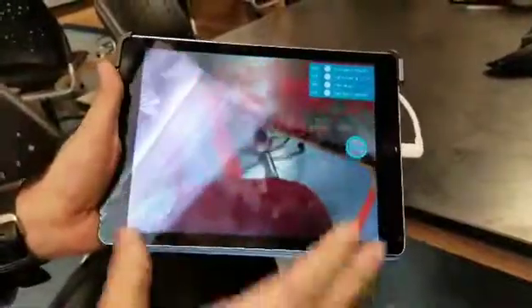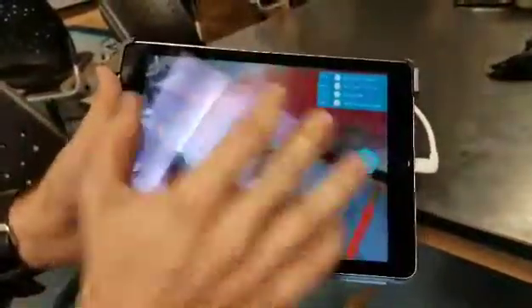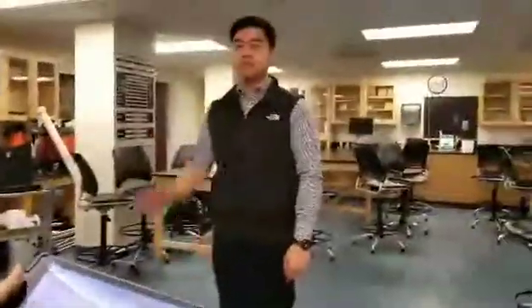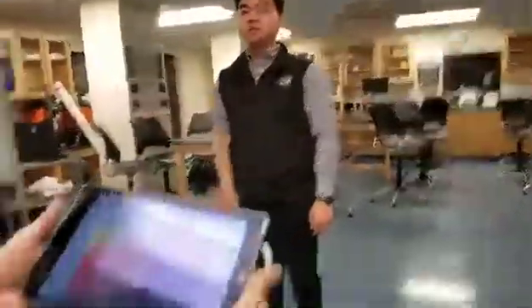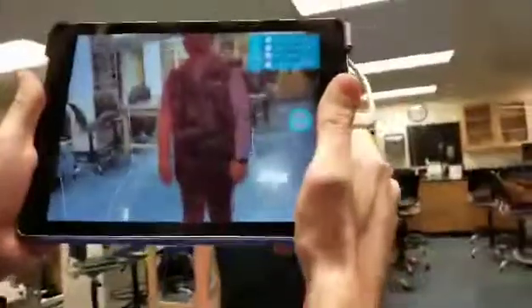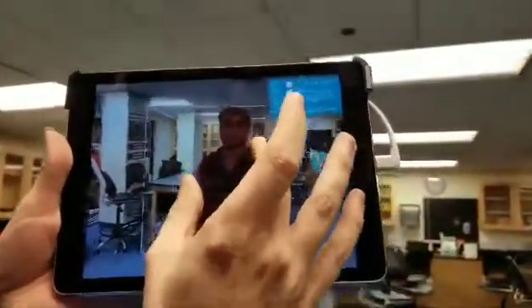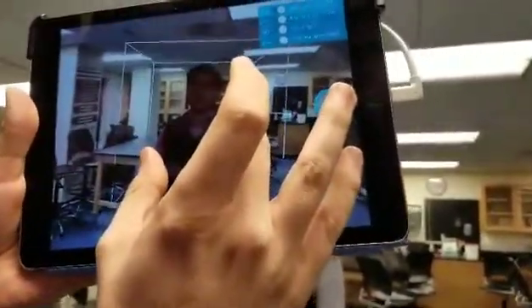So to actually make a scan, this is the view and then we can turn over to see our model. Here's our model — this is Philip. When I hold up the scanner, there's a box. That box is the scanning area, the scanning volume that I'm actually going to be using. I want to move it and scale it so that I'm just getting the part of Philip that I actually want to scan.